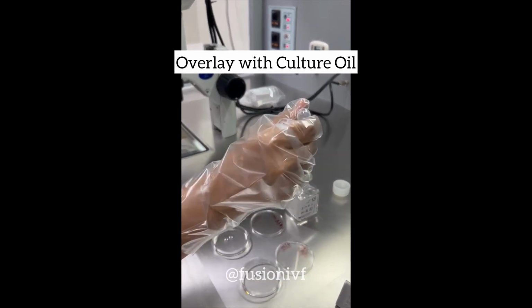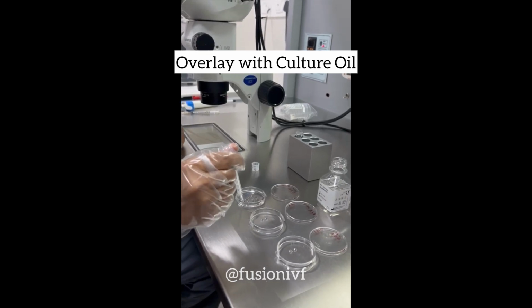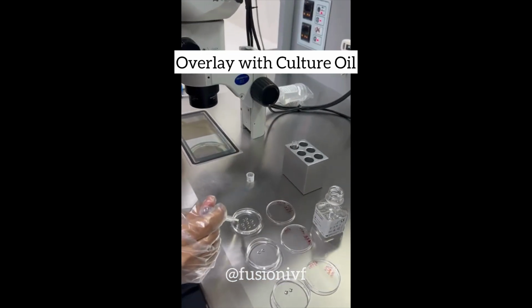Here I am layering with 4 to 5 ml of oil. Yes, 4 ml will be more than enough. But then you have to make sure that you cover all the drops with oil.